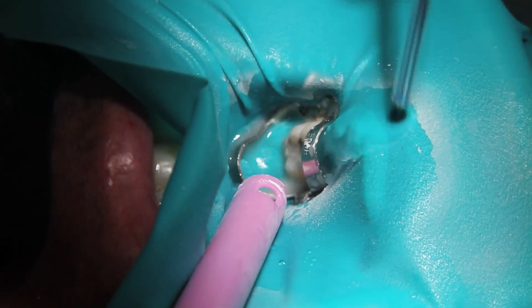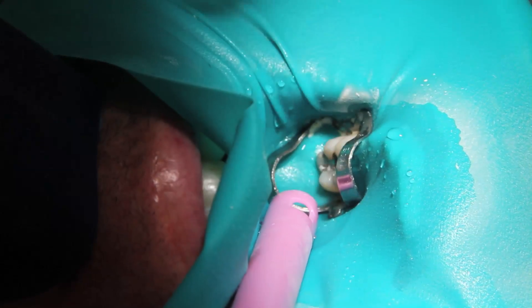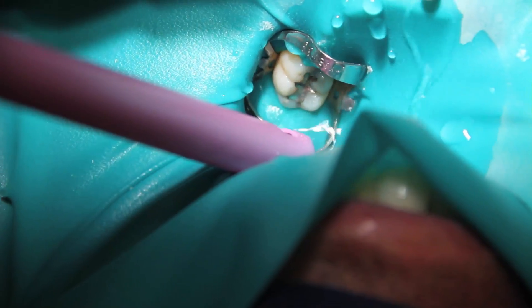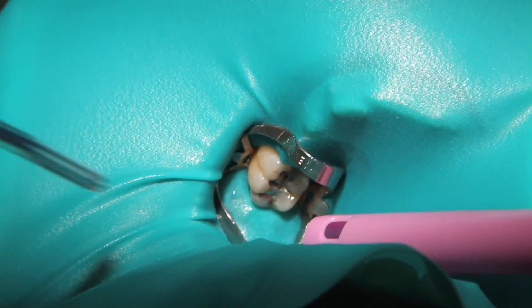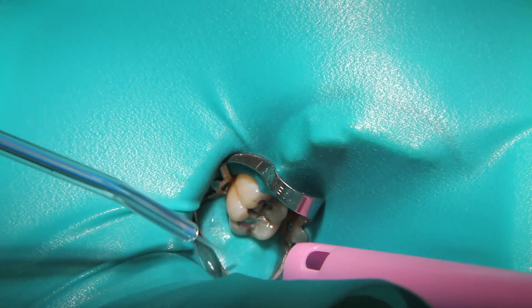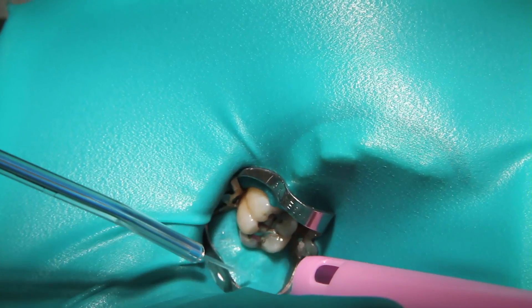Now Sarah's going to clean up afterwards. We can see that when she cleans up, she's very careful to wash the mercury toward the vacuum — her pink vacuum — and not force any water or mercury down the side of the tooth. We never blow air, and we keep the water jet away from the rubber and the tooth. Care is taken that water and mercury don't pass the tooth and into the mouth.